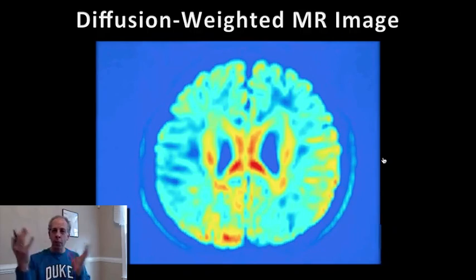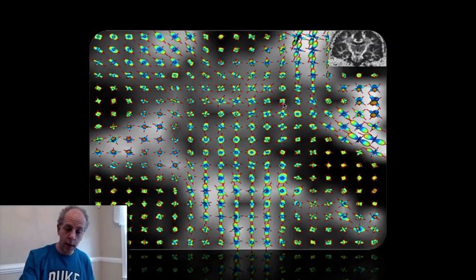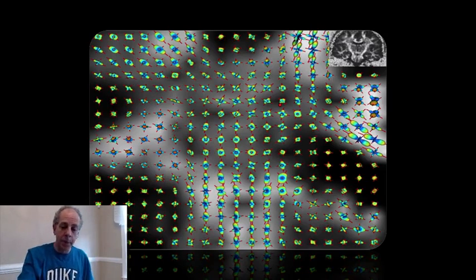So you get all these multiple directions, and from that, as we just said, you get at every single voxel in the image. We are in 3D, our brain is 3D, so instead of pixels, we have voxels. It's basically three-dimensional pixels, and this is just a slice of a brain, and we have here a zoom-in version of one of the regions.